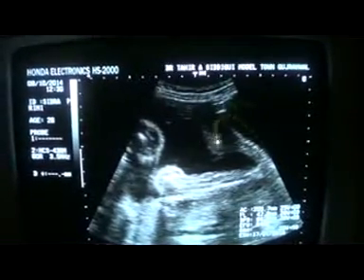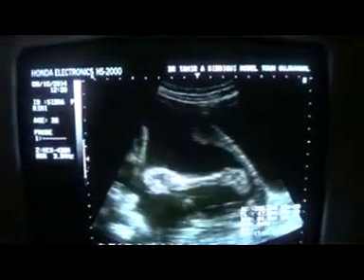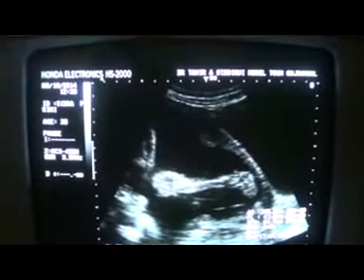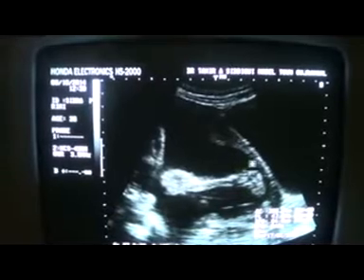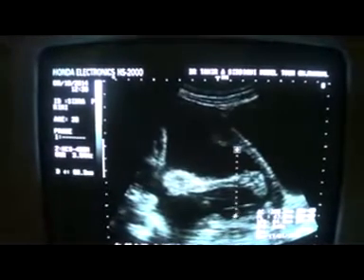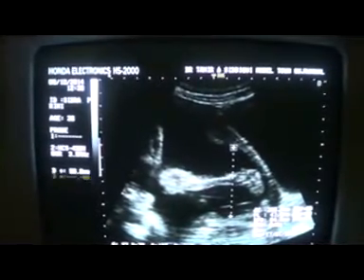This is the urinary bladder, and you will see that the foot of the fetus is, these are the leg bones, and this is the foot of the fetus that is being seen in the dilated segment. Now this is the dilated lower segment of the uterus.